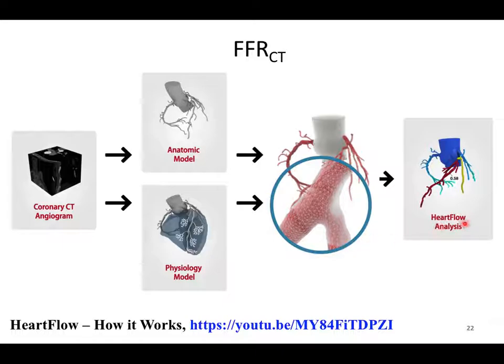This company is called HeartFlow, and I don't own shares in HeartFlow, although, you know, I admire these folks. I like these people. They've done a great job. And if you look at the drop in pressure and it's critical, then you can say, well, you should stent that stenosis, right? Just based on the CT. You don't have to do the angio.